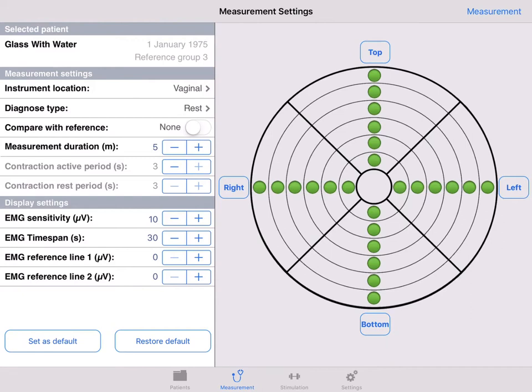I'll show you an MVC measurement compared to the healthy reference group. In the measurement settings screen, select diagnose type MVC, select compare to reference group, and press measurement on the top right.